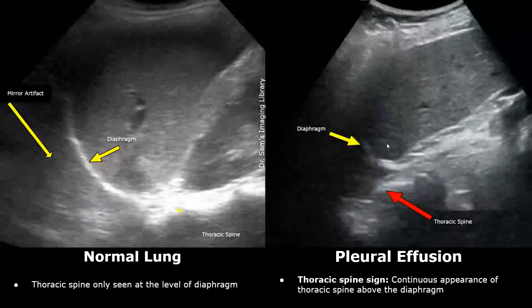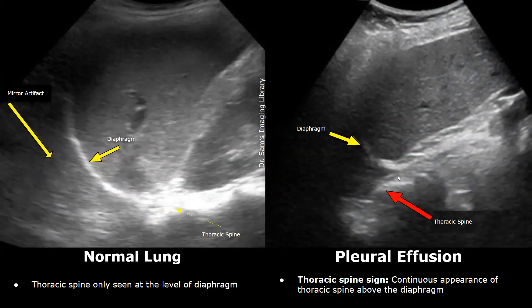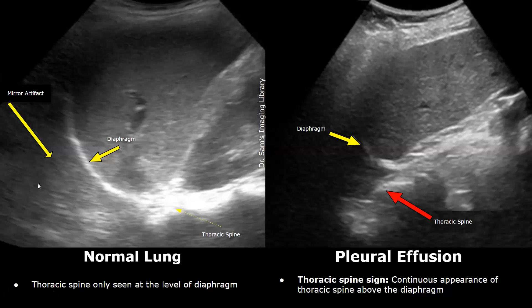This is another image showing the thoracic spine sign. The thoracic spine is visible slightly above the diaphragm, whereas in the normal image it is not seen above the diaphragm at this region. The pleural effusion is less severe compared to the previous image, which is why the thoracic spine sign is less pronounced.